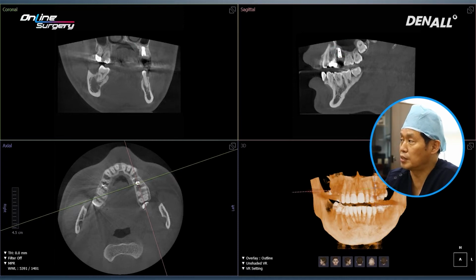After getting good primary stability using TS3 implant with good self-tapping ability, I have filled the extraction socket with SureOss and allogenic bone for bone graft and have covered it up with collagen membrane and gained primary closure.